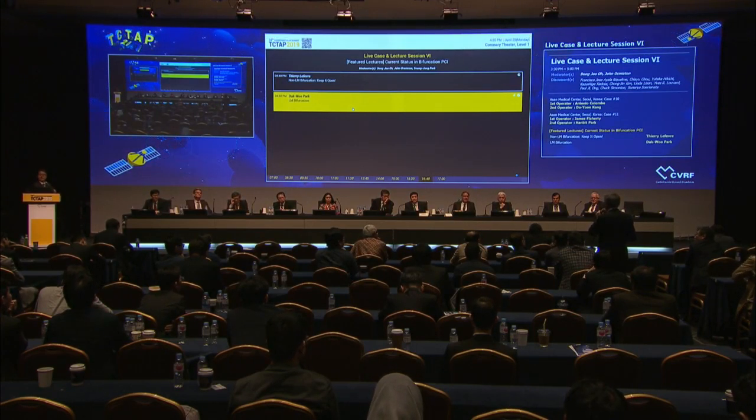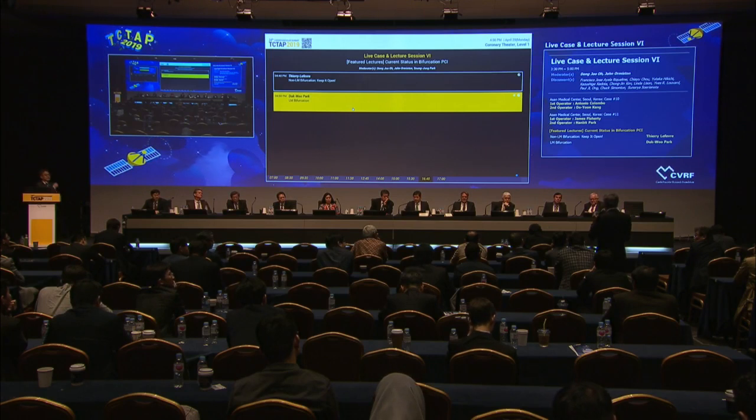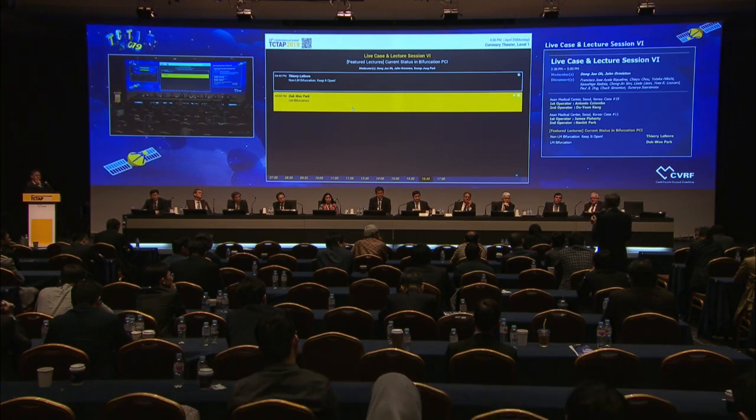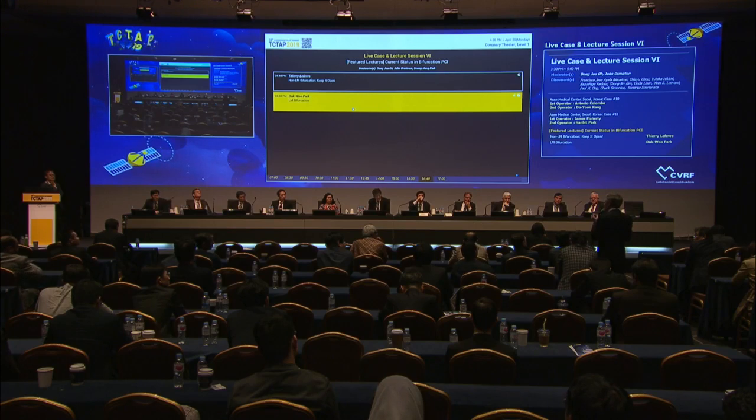Okay. Yes, that's it. I would like just to add something positive about crush. Because the crush was invented by Antonio Colombo many years ago because he missed a T-stenting technique. So because the stent was not prolapsing in the main branch, he decided to crush the stent. And then this technique made a lot of progress over 10 years. So we had mini crush, micro crush, and then Dr. Shen invented the DK crush technique.